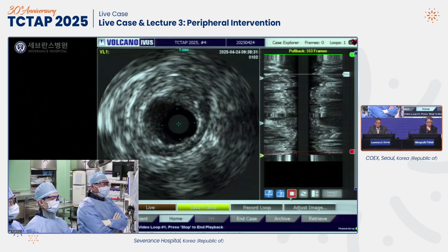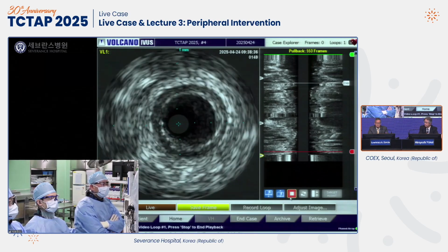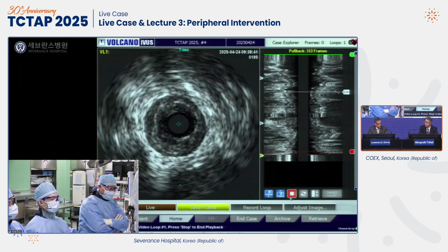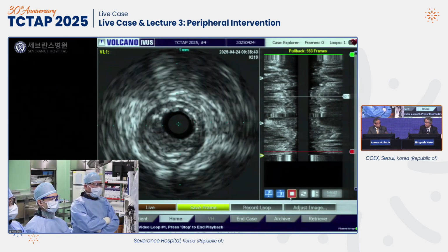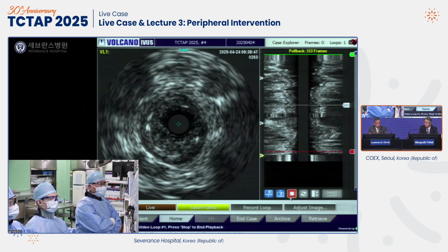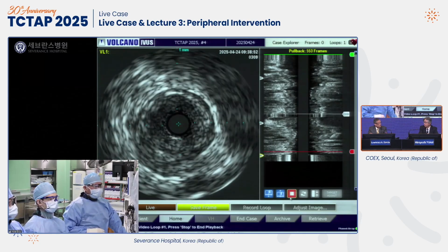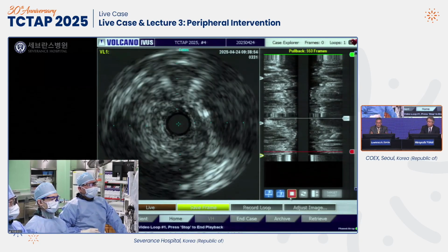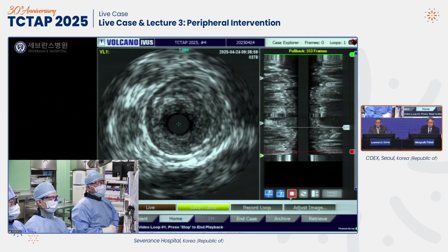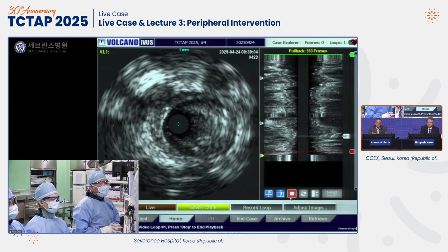At the end of the day, I think what we're dancing around is one of my pet peeves: when we do these long CTOs and we want to just do DCB and leave nothing behind, we don't know the failure mode. So if you ended up with an occluded artery to start and the outcome at 6 to 12 months is another occluded artery, then that choice is probably not useful. But if you had an occluded artery and it fails in a multifocal or a focal way, then that's a great idea. So it's a cost analysis as well. And unfortunately, we still don't know that answer, which is really a challenge in my book.